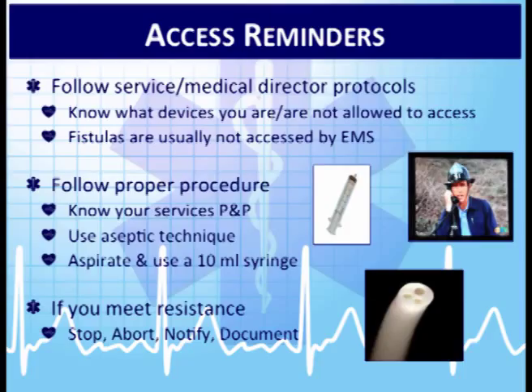Again, just a couple access reminders. Follow your department protocols or guidelines. Know what devices you are or are not allowed to access. Your medical director may say, we're comfortable with you accessing med ports, we're not going to access other central line devices, or you may be able to access all of them. Follow proper procedure. No fistulas, normally not accessed by EMS.